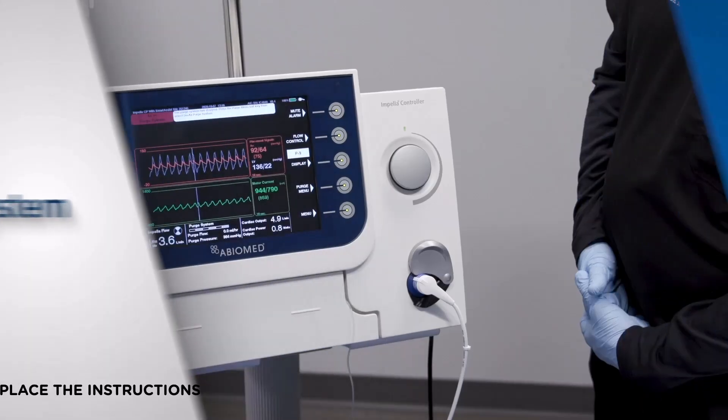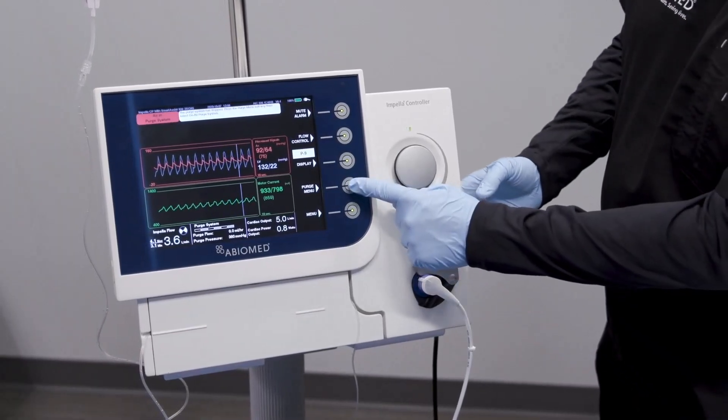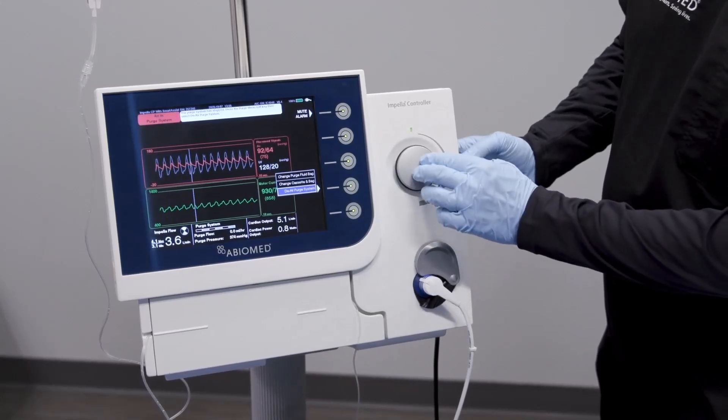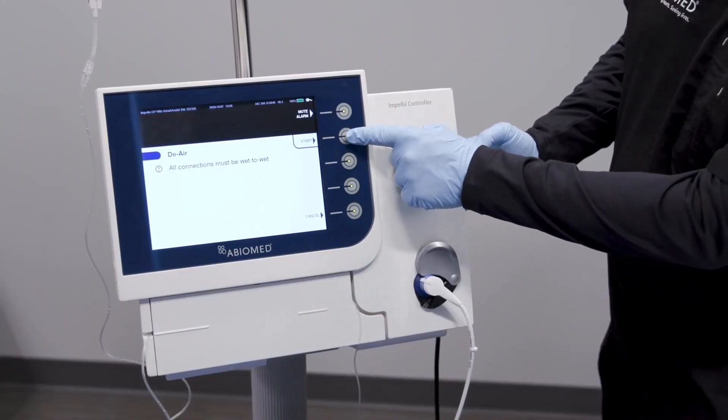To begin the de-air procedure, select the purge menu soft button. Use the selector knob to scroll to de-air purge system, then press in on the selector knob. Press start to begin the procedure.